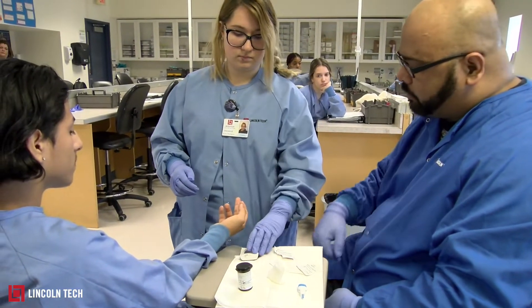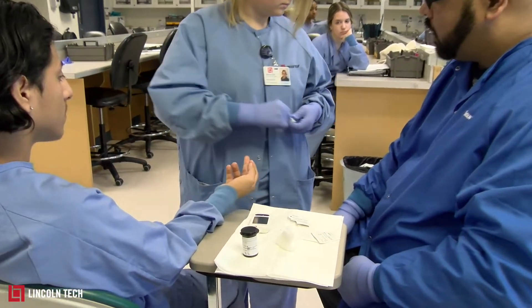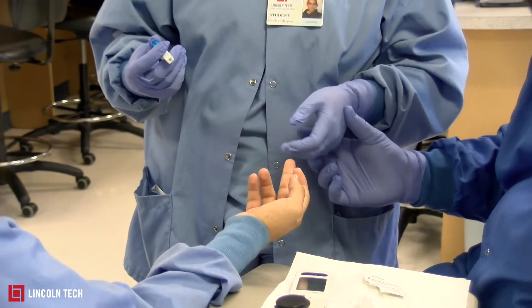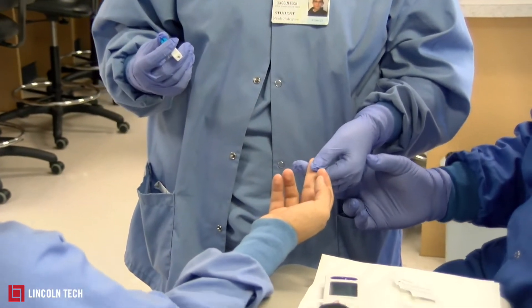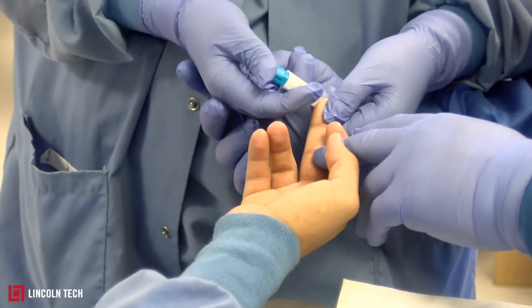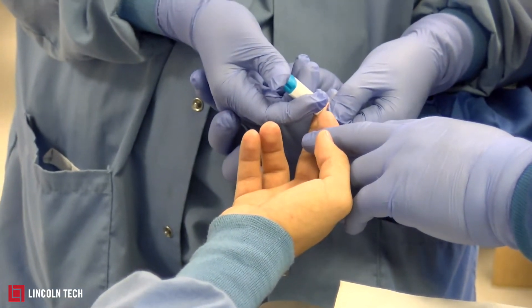She's going to grab the lancet, uncap it, and throw the cap away. Then she'll place her thumb on one side of the finger and puncture the opposite end. She applies a little pressure, presses down, and then clicks.